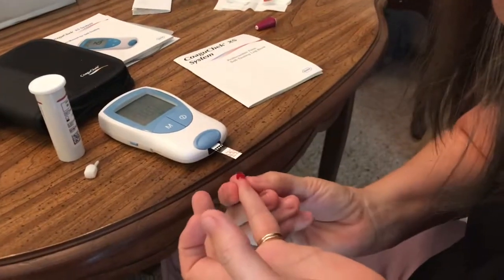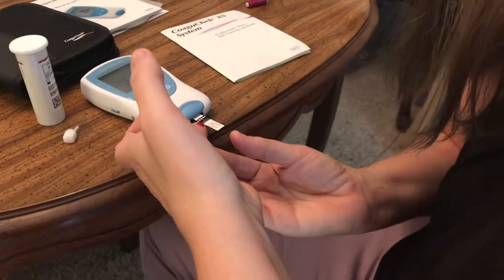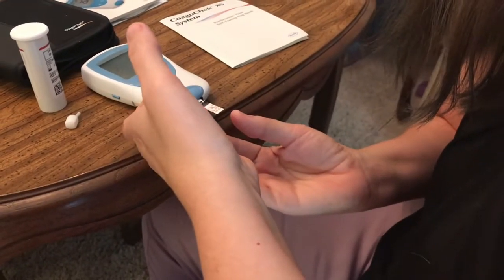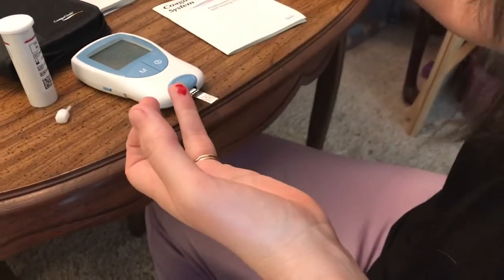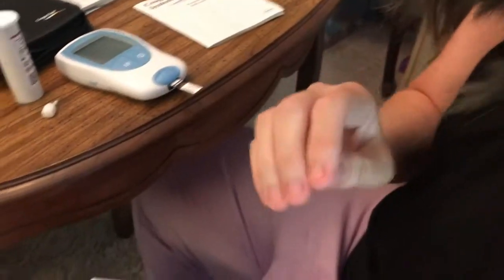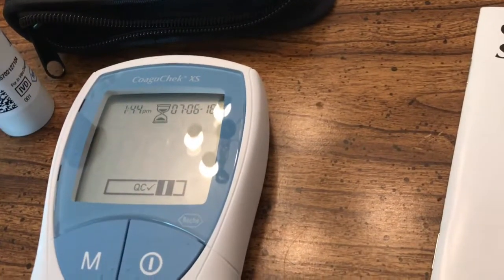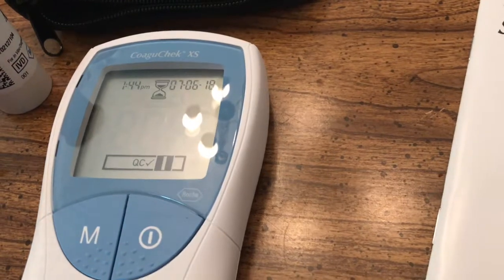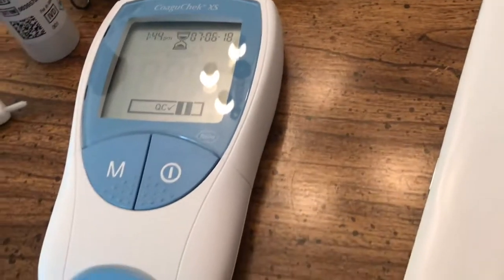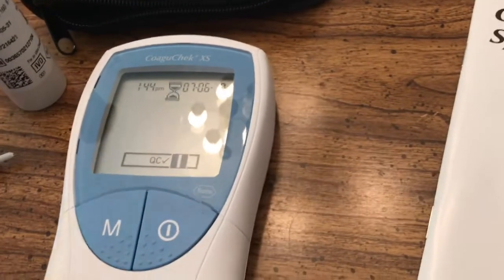There's a good little bit of blood there. What you do is just lay this right on top of the strip and your blood will just kind of suck right onto it. It will beep because now it has the sample in there. So we're going to go ahead and cover that. You'll notice it says QC check, which basically means the sample's in there and it is reading the results. In just a moment it's going to beep and tell me what my results actually are.